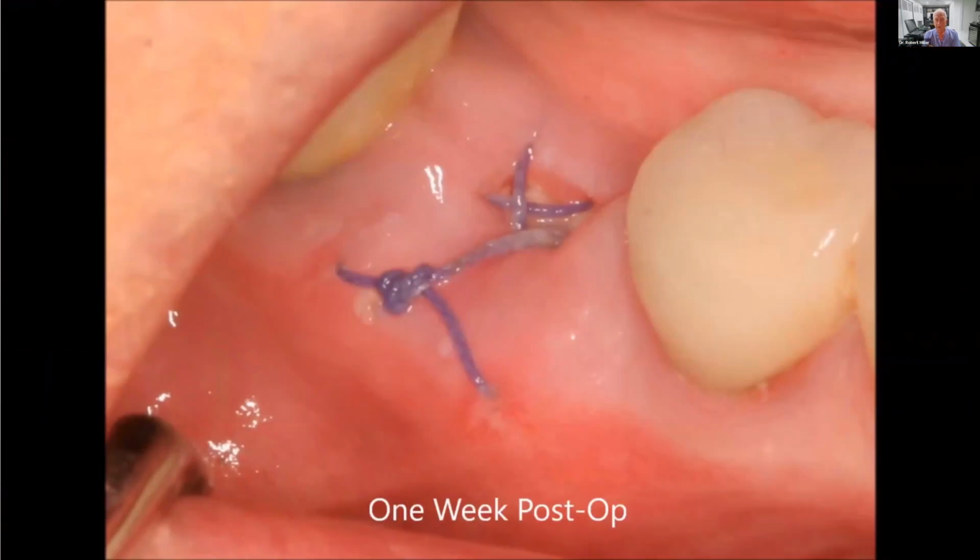Look at the quality of that tissue. Look at the thickness of the tissue. Look at the lack of inflammation. No bleeding. That graft is almost completely closed now over the top of this. And I'm going to get a great clinical outcome for this.